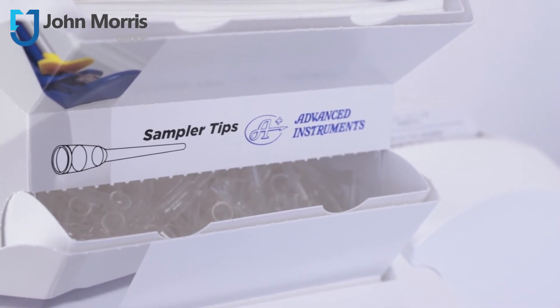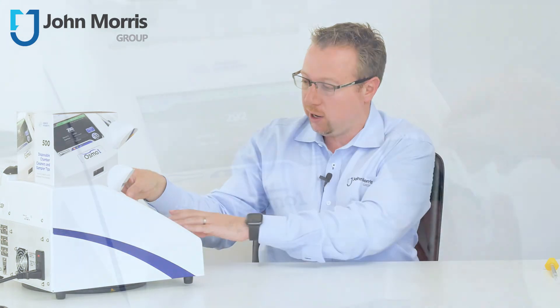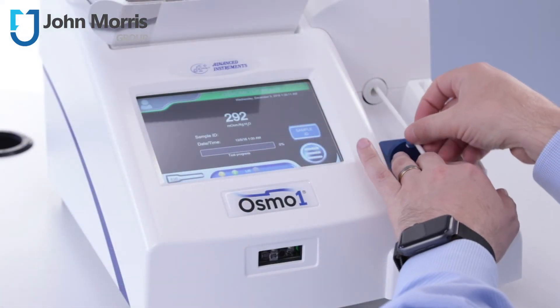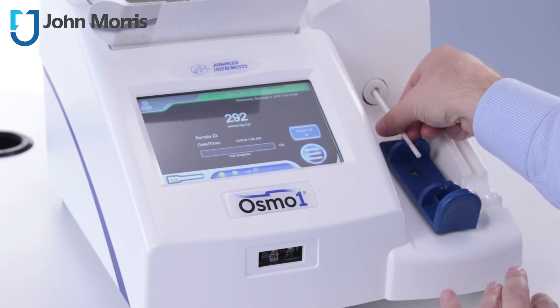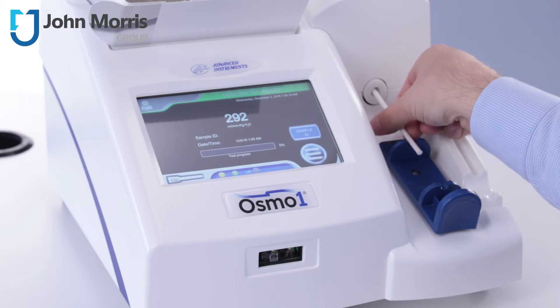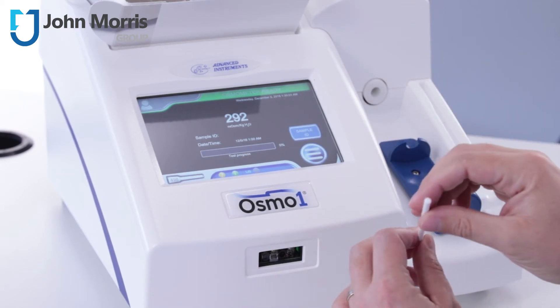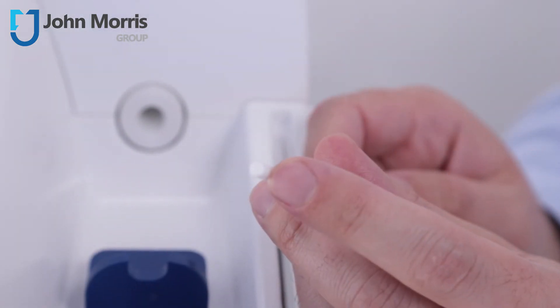Or perhaps you're reusing old chamber cleaners. To clean the chamber, take one of these, simply place it up into the probe, and rotate it left and right six times. You'll know you've done it successfully because at the end you'll have a small indentation.